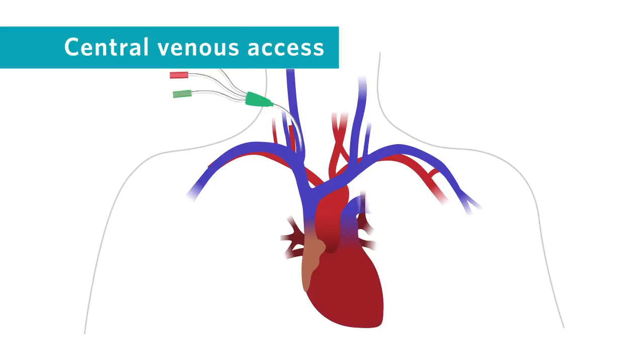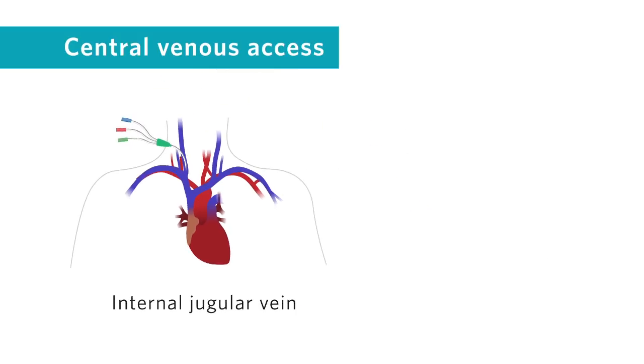In this video, we demonstrate the ultrasound-guided placement of an internal jugular central line, but the same concepts apply for femoral line insertion.